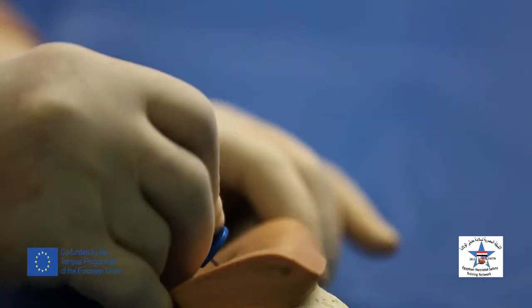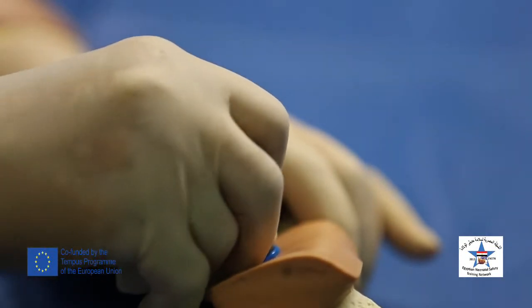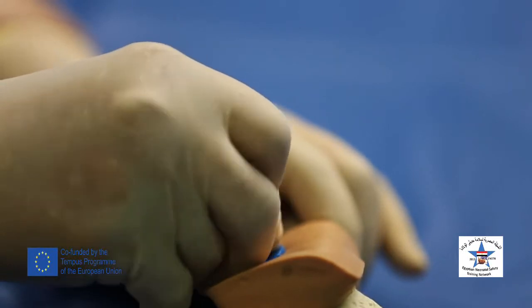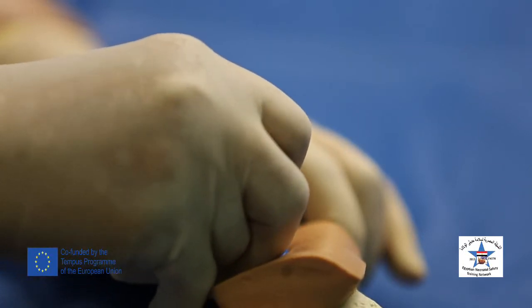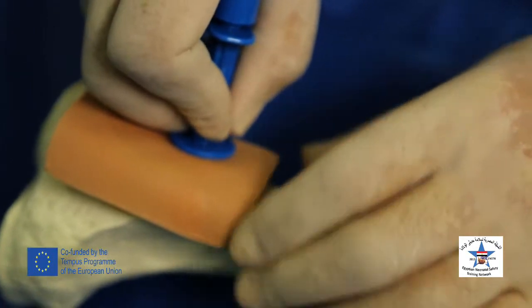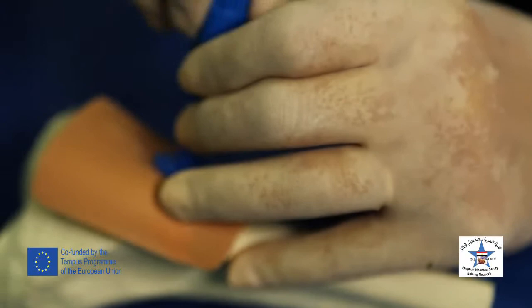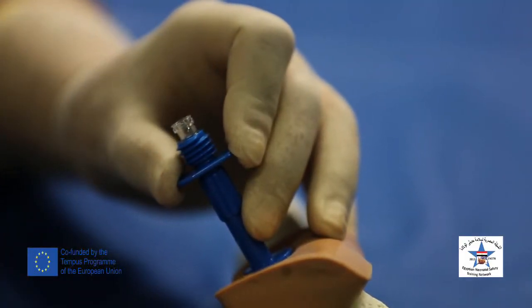After piercing the skin and subcutaneous tissue, in a screw-like movement with guided, steady pressure, pierce the periosteal bone until a pop-off or a give-way sensation is felt. Then the needle is in the marrow space. Remove the cover of the needle and remove the inner stylet.